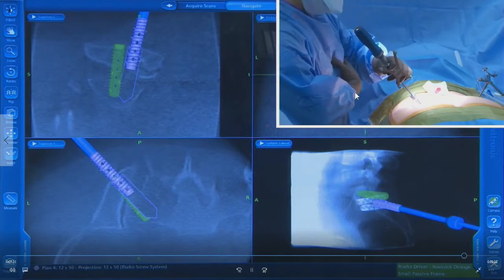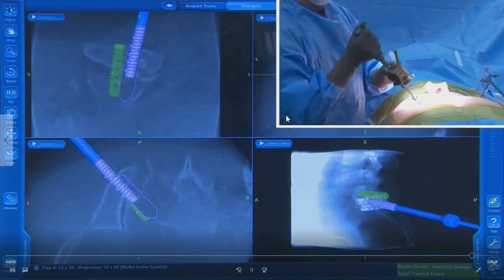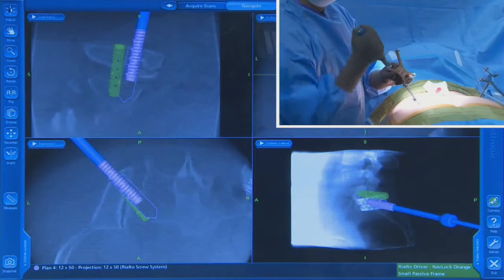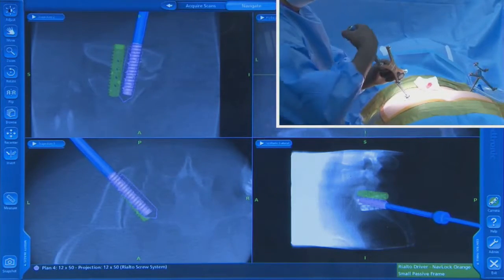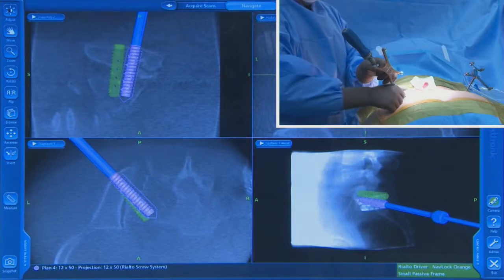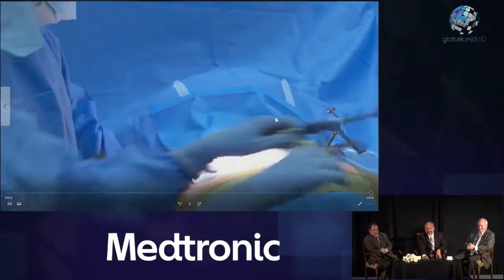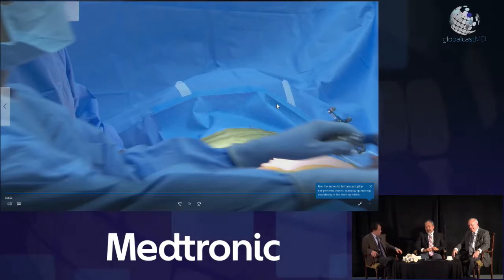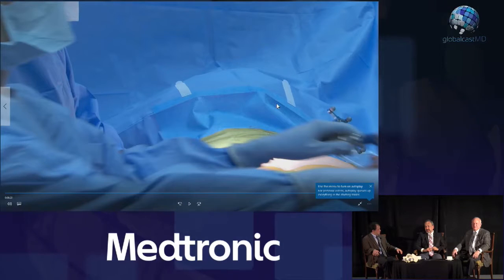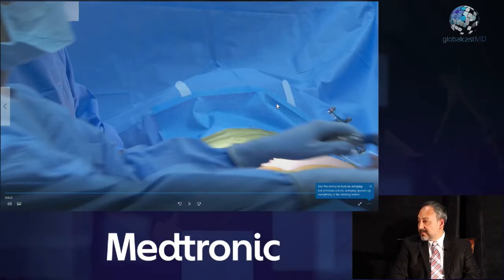I wish I could get them exactly parallel, but that never seems to be a problem. How long did this take, skin to skin, excluding the scans? It's going to be about a five to seven minute procedure. There's the second implant — I'm ready to sign up! And then we're taking that out and that's the end of the operation. The skin closure is a single 2-0 Vicryl into the dermis and then glue. In this case our incision is about a centimeter and a half to two centimeters — basically just big enough for that tap to fit through. Well, nicely done.